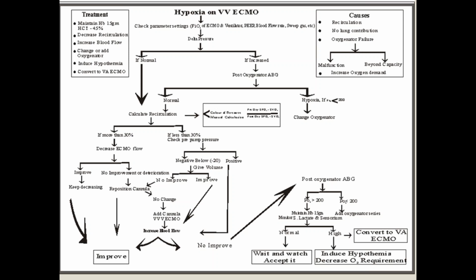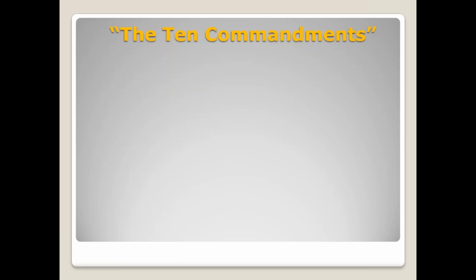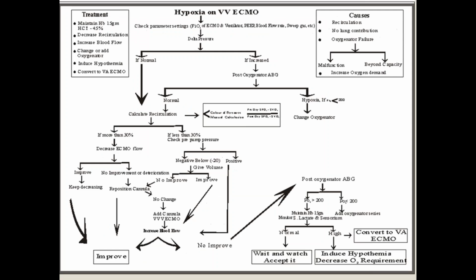Will decreasing the flow correct hypoxia? Yeah, I'll tell you. In fact, I'll discuss recirculation separately, and at that time I'll tell you. But what happens is, as you increase the flow, the recirculation flow increases, but your effective flow decreases. That's the reason you have to decrease the flow, then you get more effective flow than recirculation. But that I'll discuss as a separate topic.